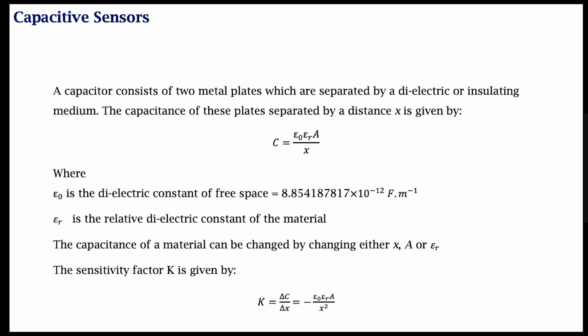Another plate is not a rigid body, and its dimension or geometry is going to change depending on the pressure that is applied, depending on the sound waves that it is detecting, depending on various physical phenomena happening around it.